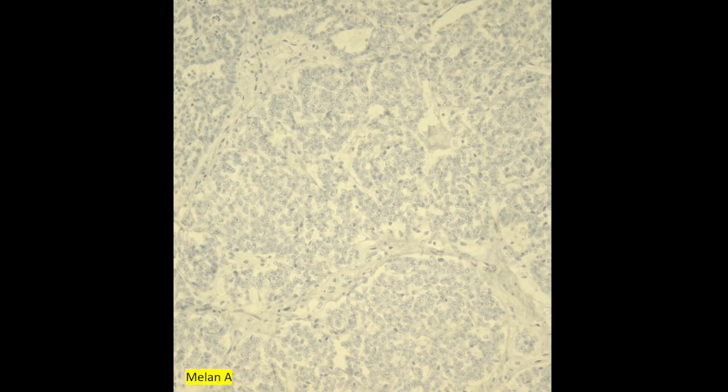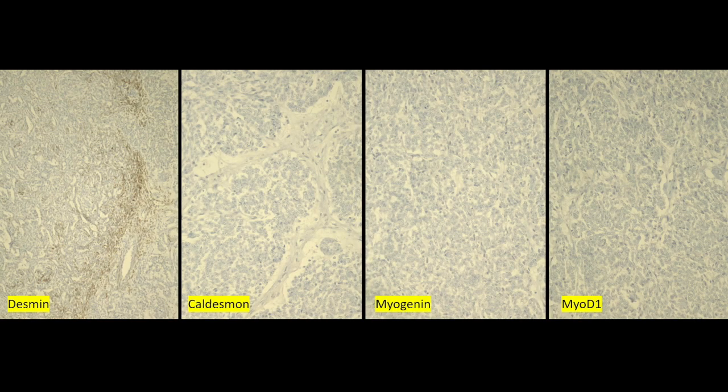SF1 was positive in clear cells and subsets of spindle cells. Inhibin was positive in clear cells as well. We did an additional marker, melan-A, which was negative. For muscle markers, only desmin was positive. Other muscle markers like caldesmon, myogenin, and MyoD1 were negative.